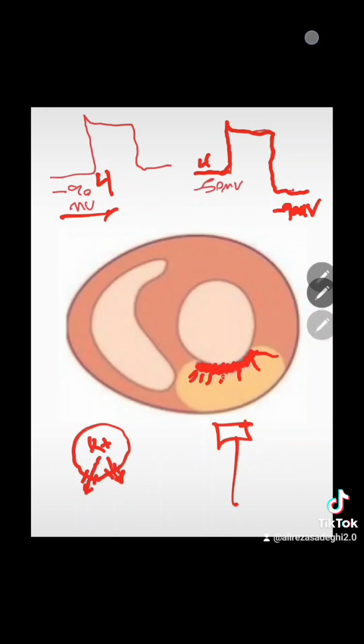Because this early depolarization occurs towards a positive lead, what you will end up with is a QRS complex where the isoelectric line starts more positive, then you will have your QRS complex, and then your ST segment goes back to where it should have been originally. And for this reason, subendocardial ischemia causes ST segment depression, when in reality, all that happened was the beginning of your QRS complex was elevated.